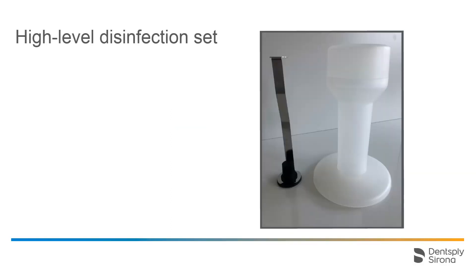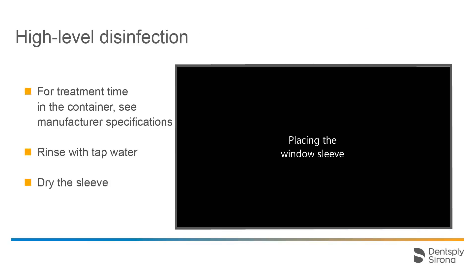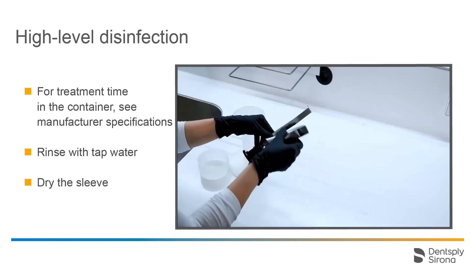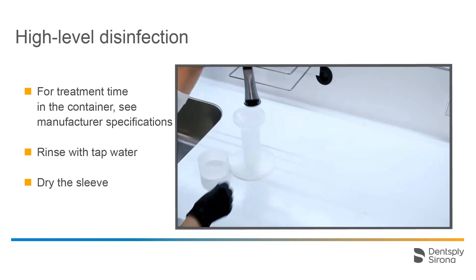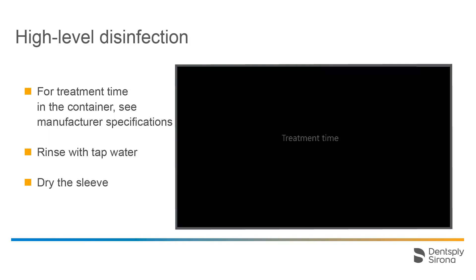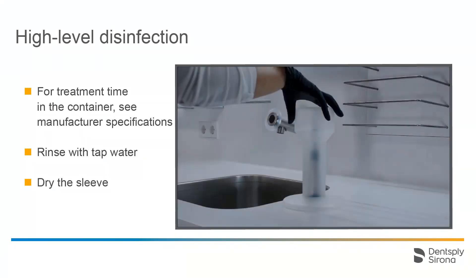For high-level disinfection, a set consisting of a container with lid and a metal bracket with plug is needed. This set can be purchased separately. The disinfectants approved for this procedure can be found in the current instructions for use for the CEREC PrimeScan. Before the high-level disinfection procedure can be started, the sleeve should be pre-cleaned as outlined above. Press the sleeve onto the plug while holding the metal bracket firmly in place in order to ensure that no particle contamination or fluids penetrate the inside of the sleeve. The container should be filled up to the mark with an approved disinfectant and the metal bracket with the sleeve placed inside it. We put the lid in place and let the disinfectant work. Please follow the manufacturer's instructions for the recommended treatment time.